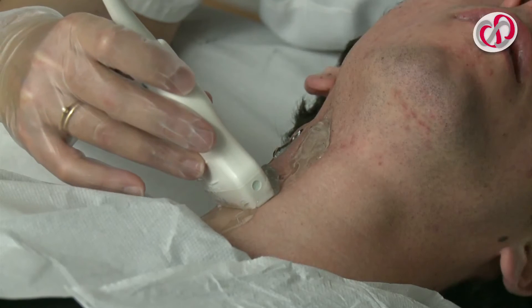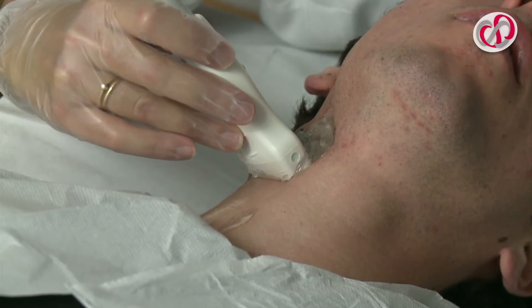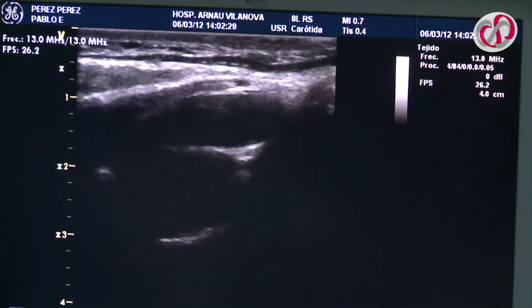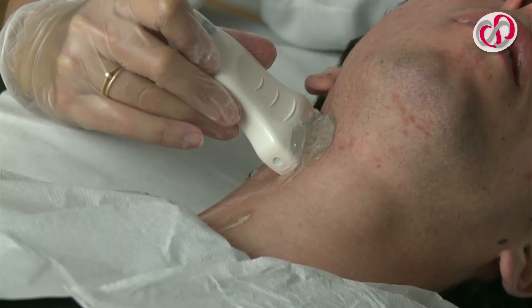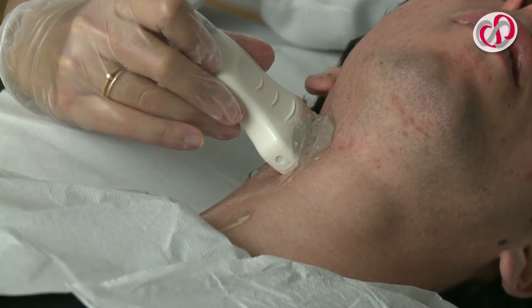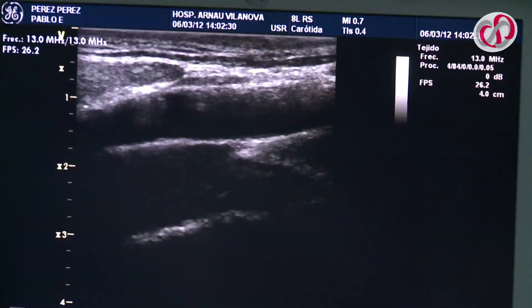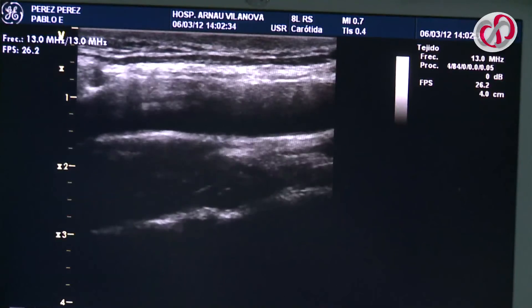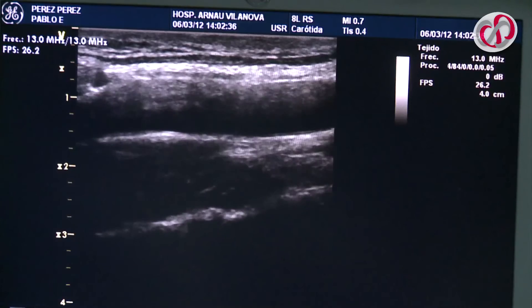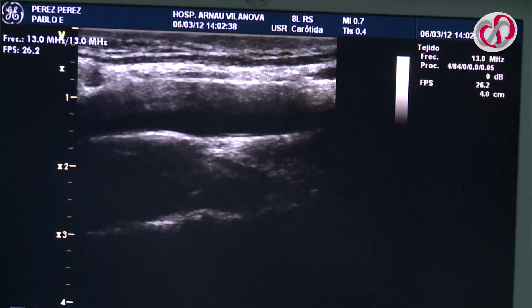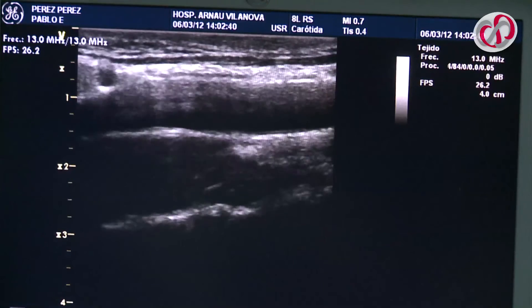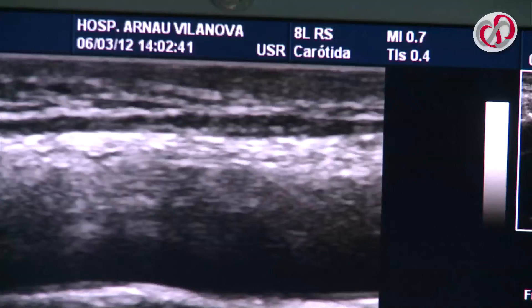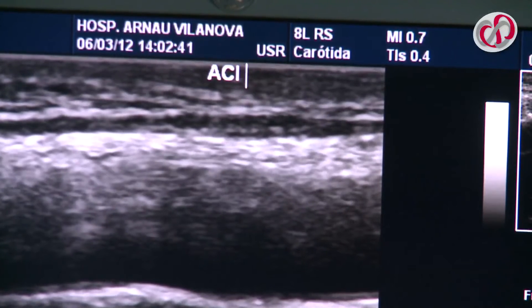In order to obtain a good image of the intima media thickness of the internal carotid artery, we make a cross-sectional exploration of the carotid as far as the bifurcation. After the bifurcation, we rotate the probe longitudinally until we obtain a good image of the bulb and the internal carotid artery. The image is captured, identified with the corresponding name, and saved.